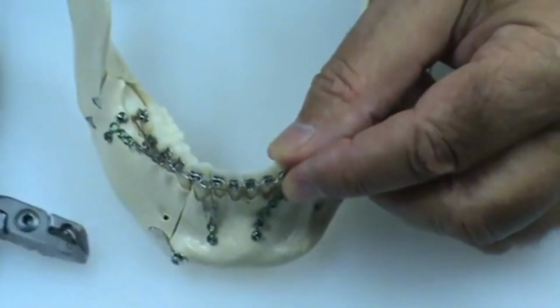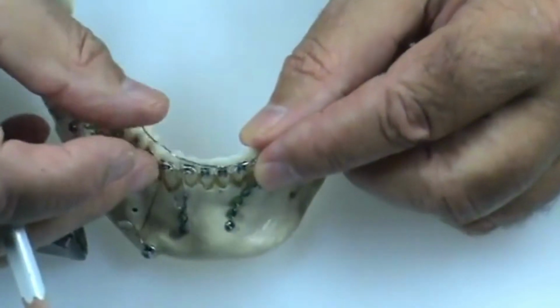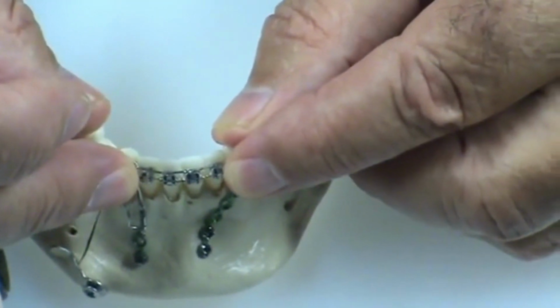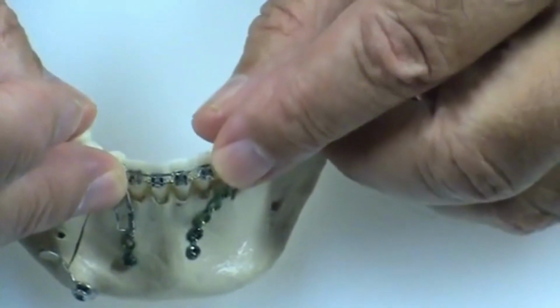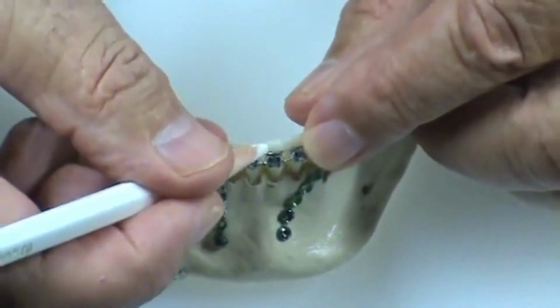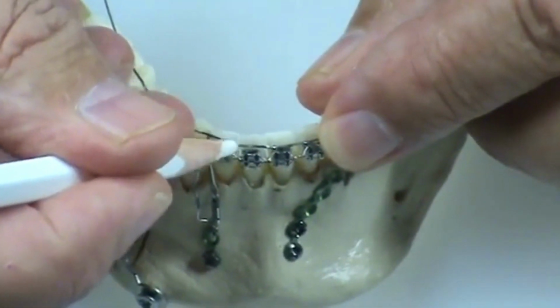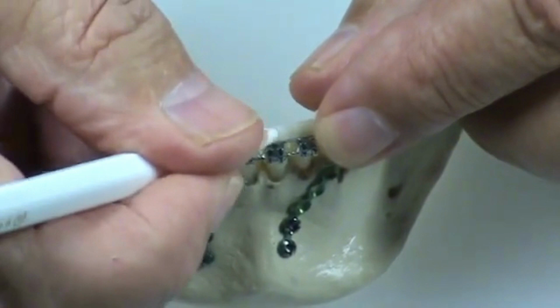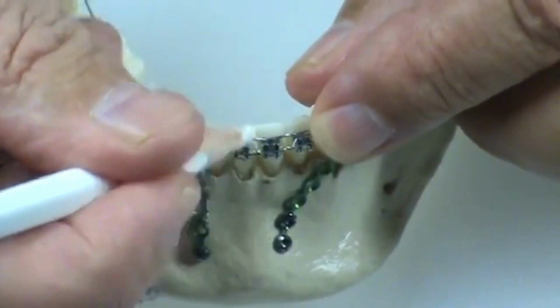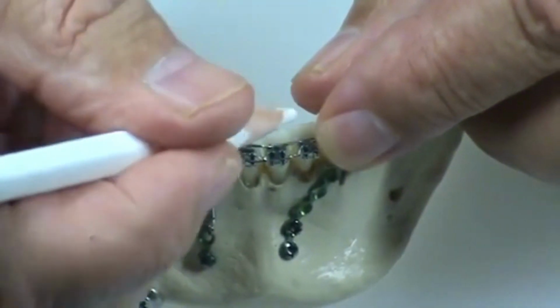Okay, now it says that what was actually done in this case is on 3-1, you can see that the tooth is kind of down, and 4-1 we need to step it up a little bit more on the mesial. So there's a bend already on the mesial, so mark both sides, mesial and distal. Just ignore that there are bends there, to tell you the truth. Just act like it's just a regular straight wire.